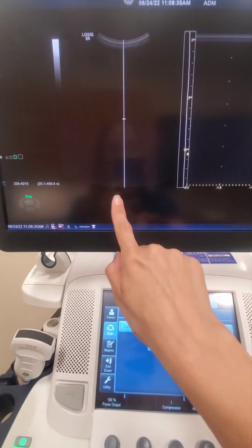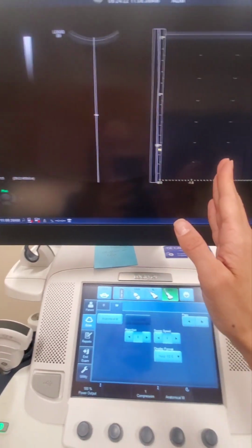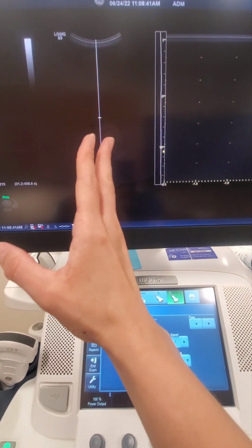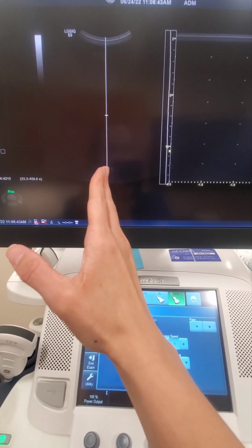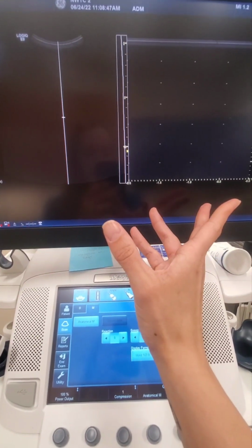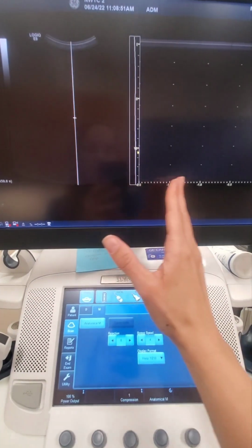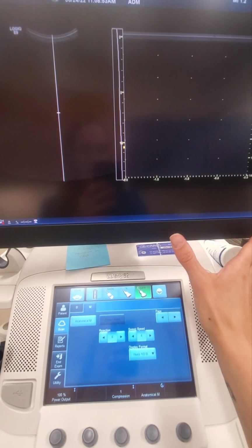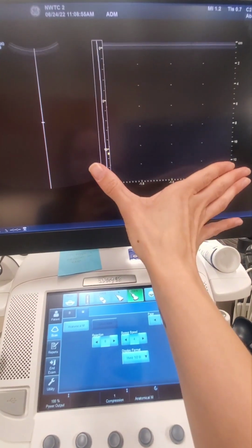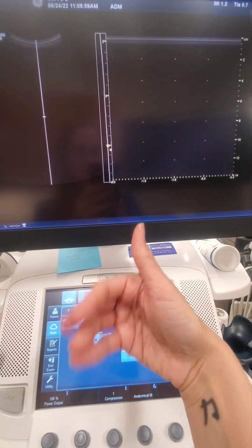We have this one scan line down that's going to give us information across time about how the heart moves. And then we can measure the rate of that movement, the heart rate. We're not building a frame of a picture, we're building a graph. Okay, this is not going to be an image, this isn't a picture of what's inside the body.